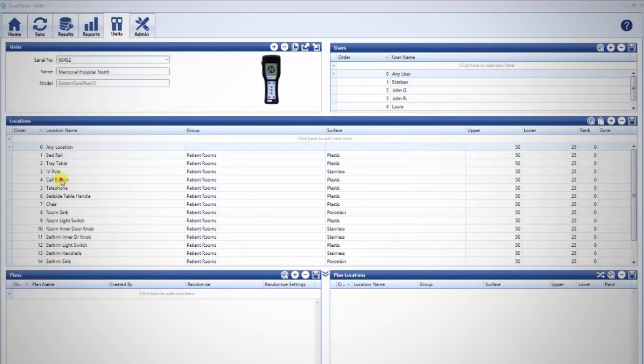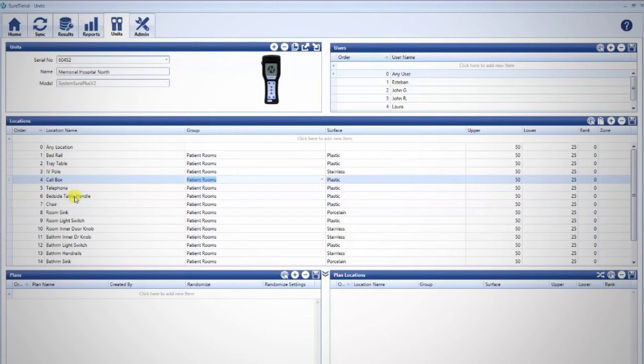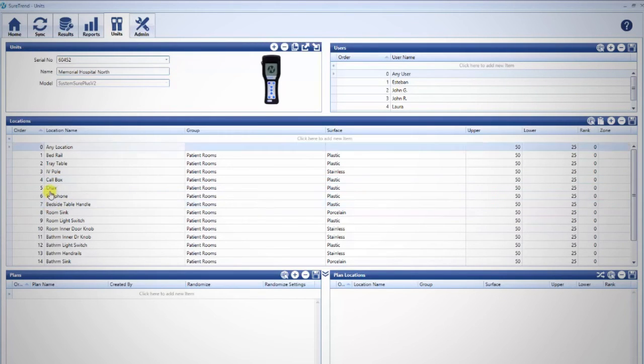Fields can be modified by clicking twice in the field. You may rearrange the order in which locations will appear on the unit by clicking, holding, and dragging rows to the desired position.